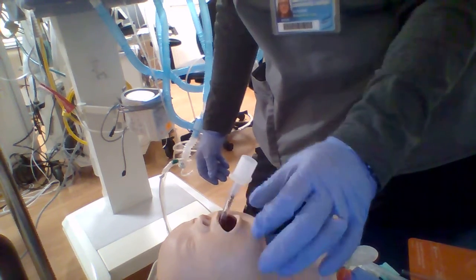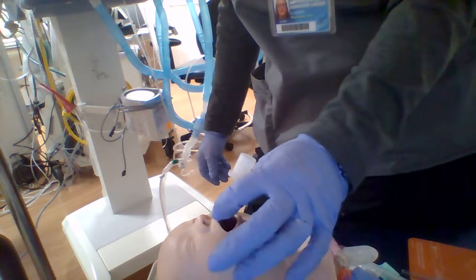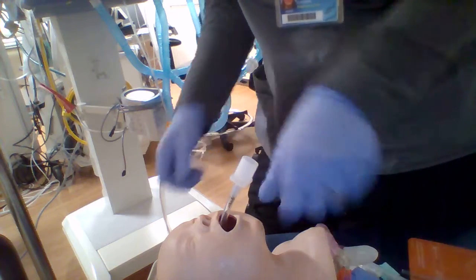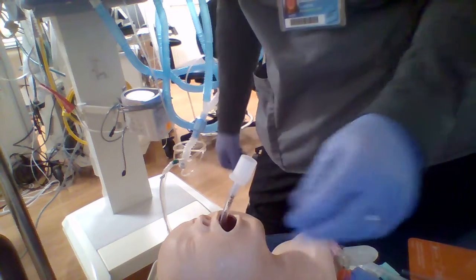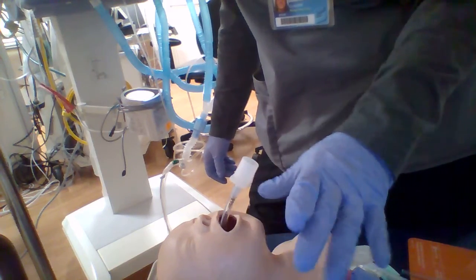This is a cuffless tube because it's an infant, but you would want your cuff pressure to be right around 20, 25, maybe 30 at the tops. And you just take a manometer and put it into the little bulb at the end. So that would cover all of that, oral care.